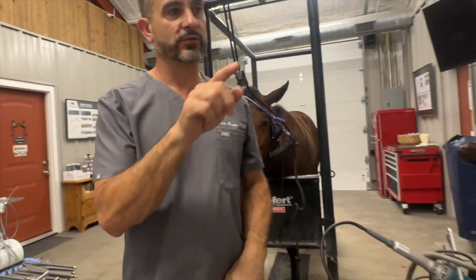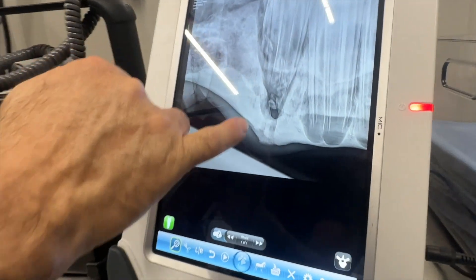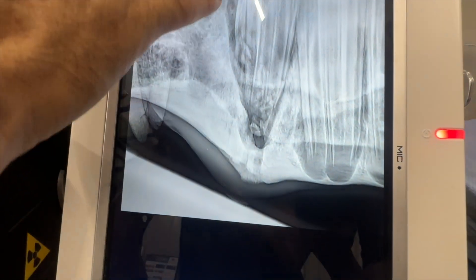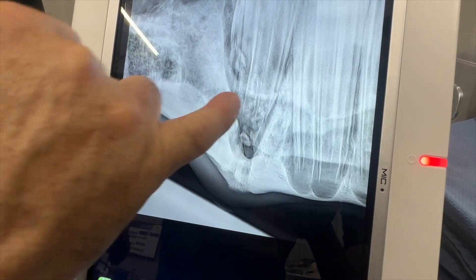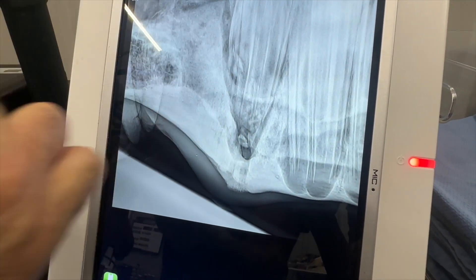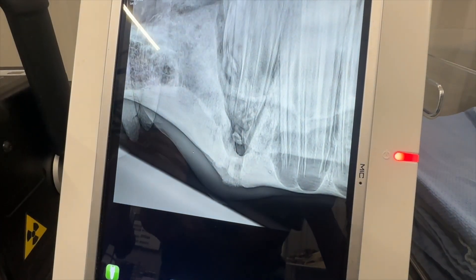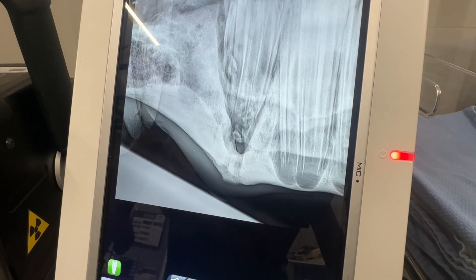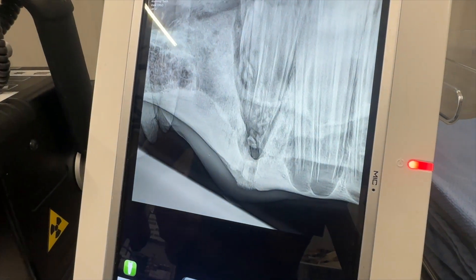We took a radiograph. We can see a callus around the fracture area, a very widened periodontal space in this region, and a clear periapical abscess — a bad tooth. Part of the challenge is that this horse is only two years old, so there's not a lot of clinical crown because it has a cap. But for this region to finish healing, we must remove this tooth.